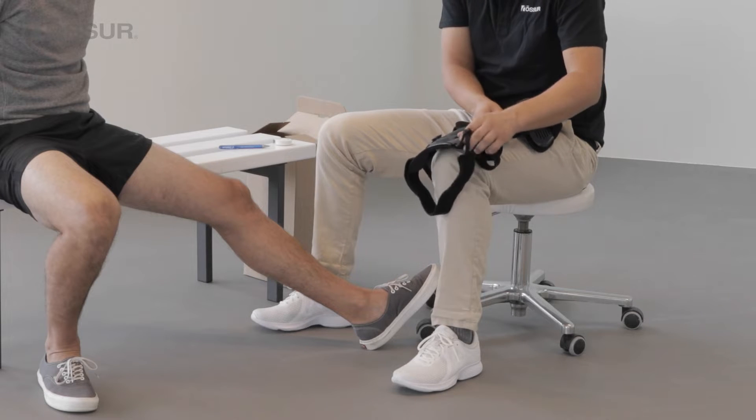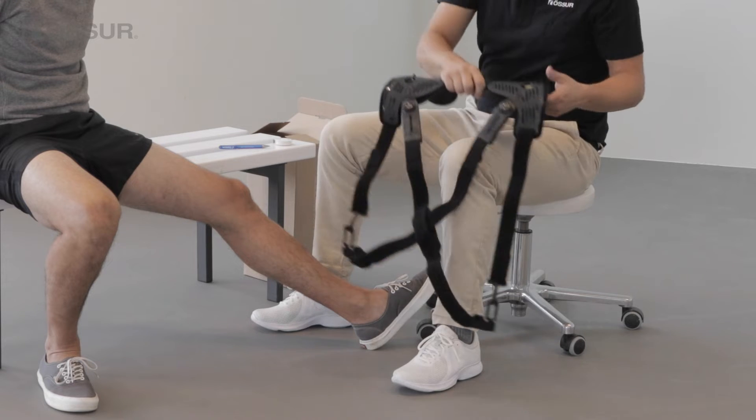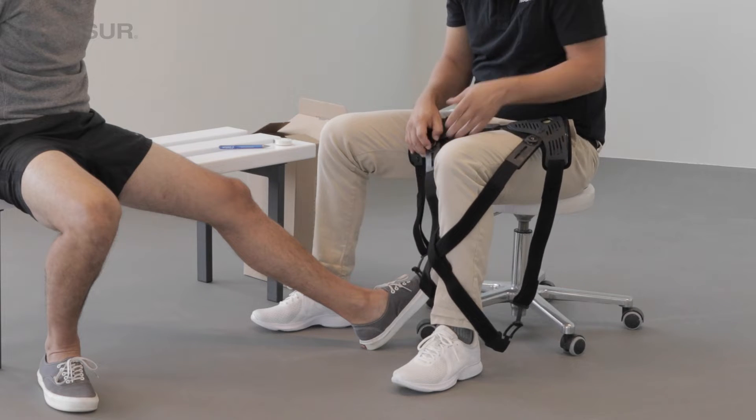Open the upper and lower quick fit buckles. Turn both smart dosing dials until the blue indicators are at the lowest setting.